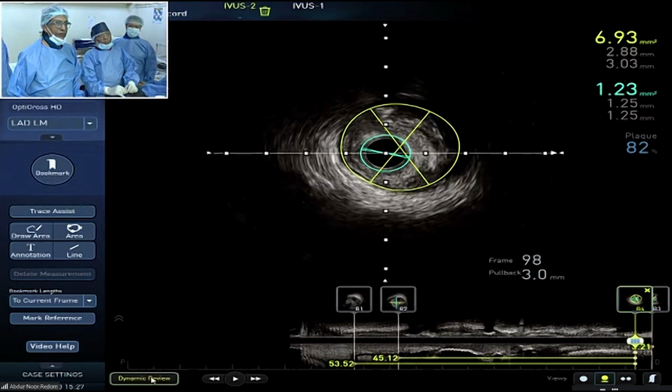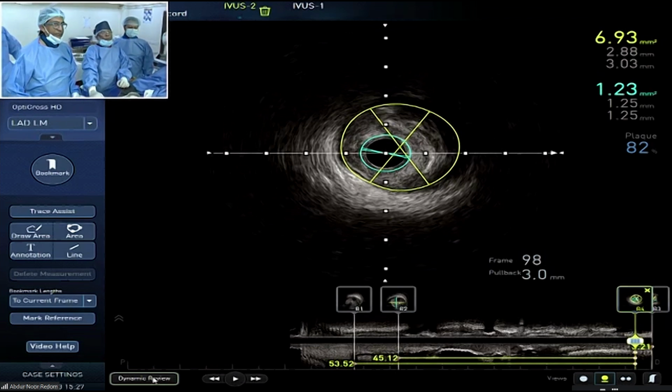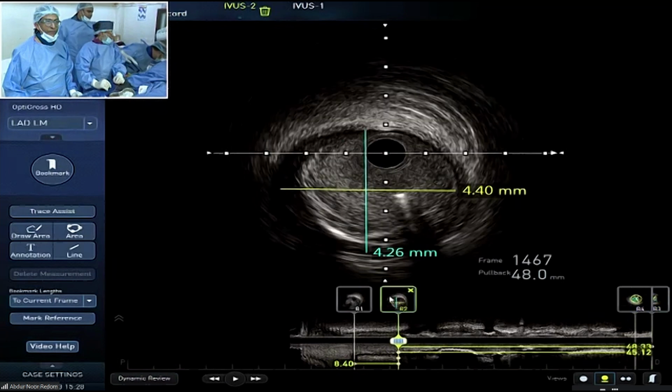But the proximal diameter is 4.5, 4.4. So you want to dilate proximally with a 4.0? We have to go with 4 or 4.5 depending on our IVUS pictures. Here it is 4.5. So do you have any stent selection? Who can go 3 to 4.5?